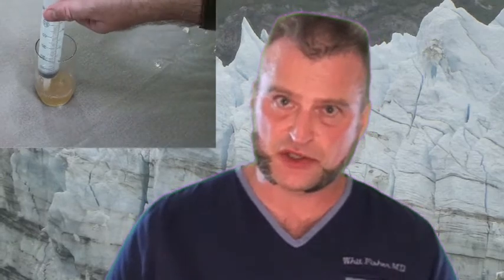Usually. Sometimes, in tough cases, I'll get a little pancreatic enzyme sent up from the pharmacy in the hospital, such as Creon is one brand name. You gotta remember that these enzymes normally operate under alkaline conditions. So when you get the pancreatic enzyme powder, you can dissolve it in some saline, but try and add a couple of drops of sodium bicarb to the mixture, then put it into the G-tube and let it sit there for 30 minutes. With a little luck, the enzyme will munch away at that clog and it'll flush easily.